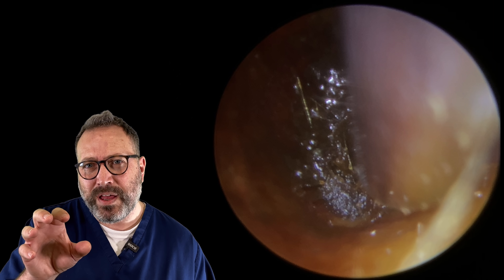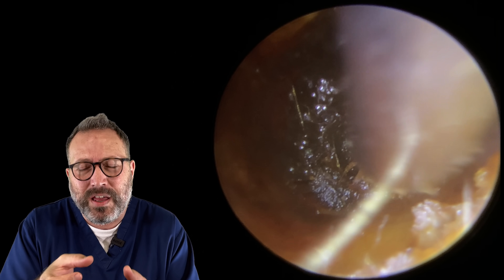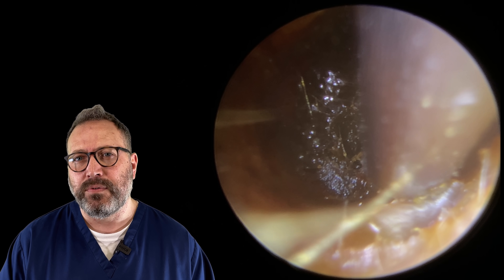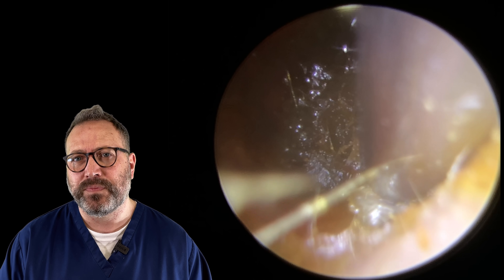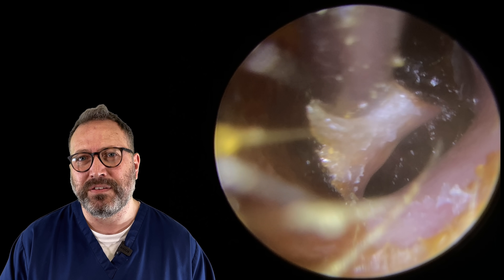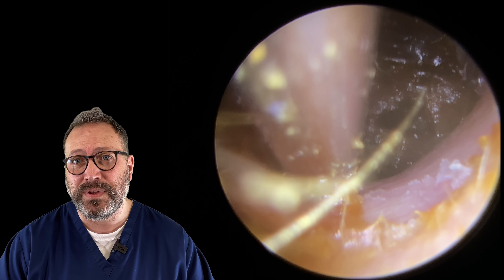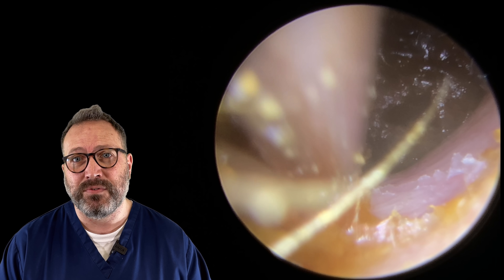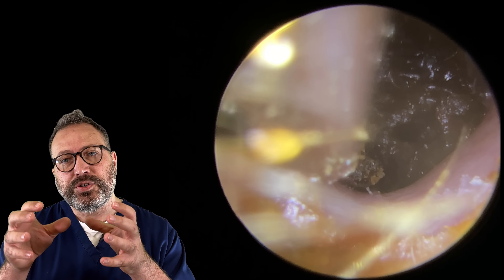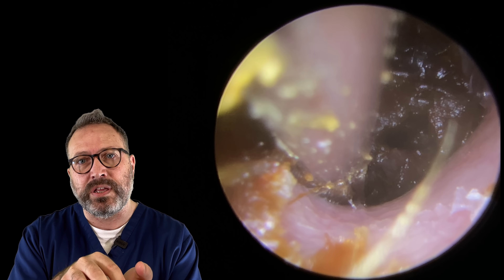We've got a good grip now, just lifting. You can see us trying to tease this away but it got stuck, so we're going to come back again and see if we can peel down to that layer. We've got a good peel going now - lifting up and it should meet that layer we've just peeled. Watch what happens to the bottom left - as we take that away it started our next peel. We're going to grip this and draw it down the canal. Now we've got a much better idea: you can see the skin on the ear canal and where the skin ends and the wax on the eardrum begins.